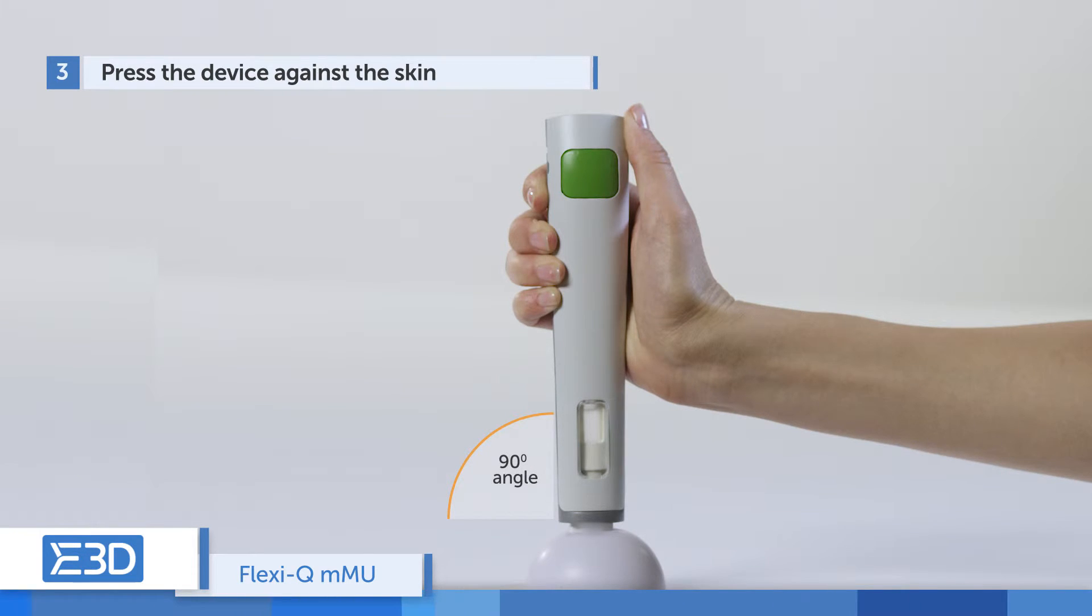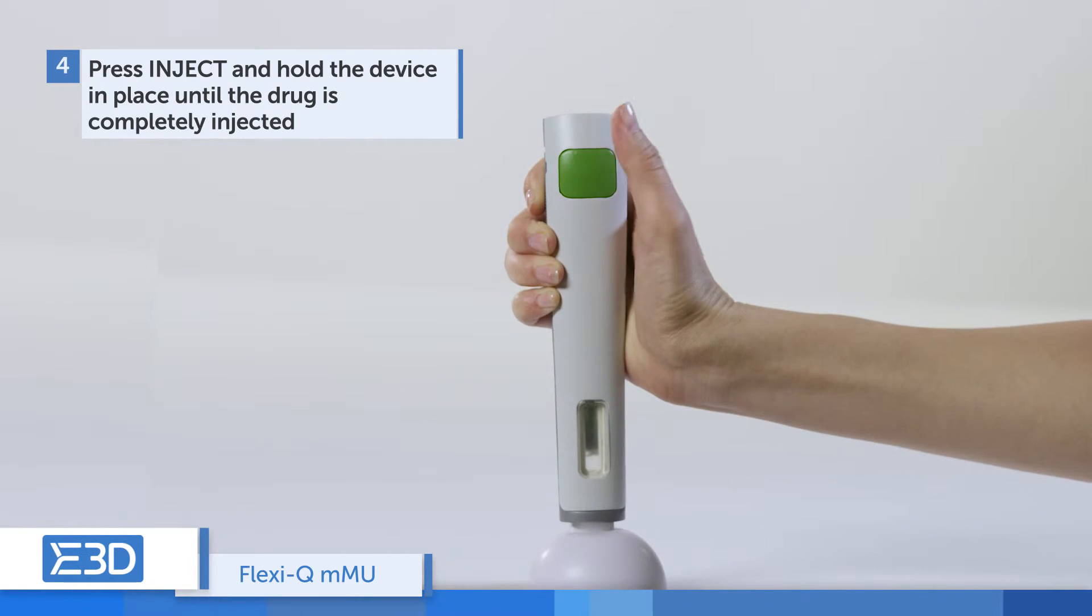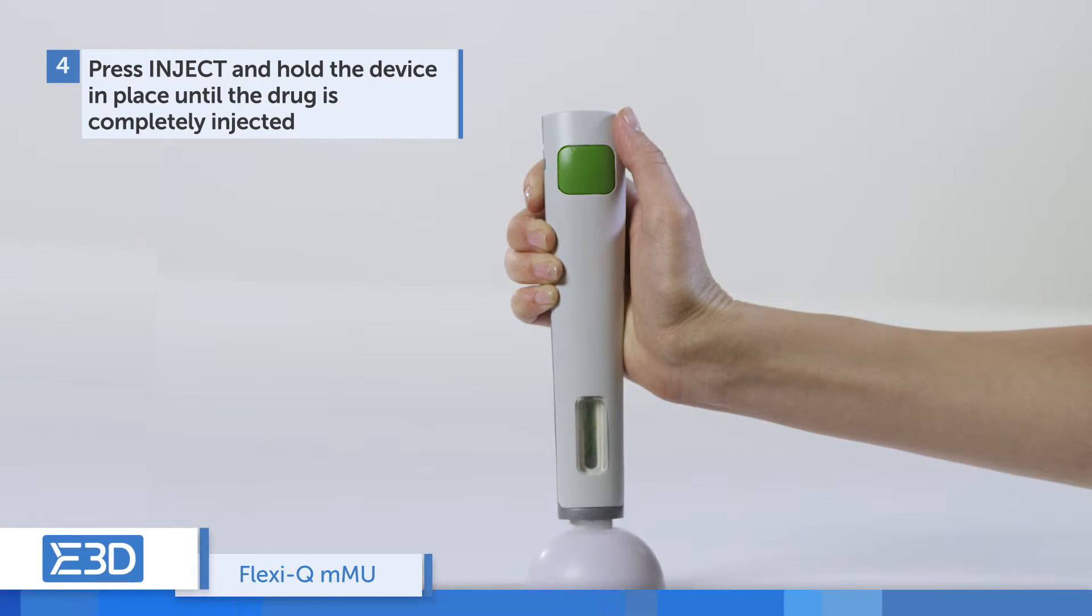Press the device against the skin. Press the Inject button. The drug is automatically injected after full needle penetration.